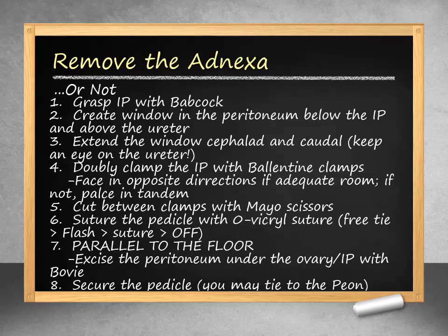Next, we will remove the adnexa. If you are not removing the adnexa, this step may be omitted and the adnexa removed at the level of the cornua from the uterus. To remove the adnexa, first grasp the IP ligament with a Babcock clamp and gently elevate. Next, create a window with bovie electrosurgery in the peritoneum below the IP but above the ureter — you have already identified these structures. The incision is then extended cephalad and caudal parallel to the IP.